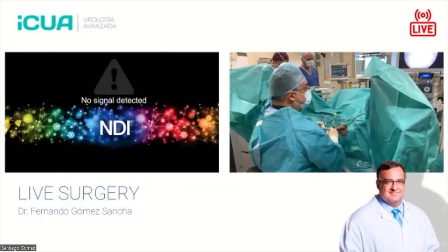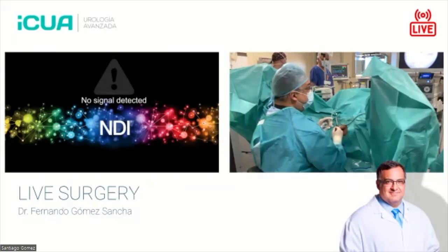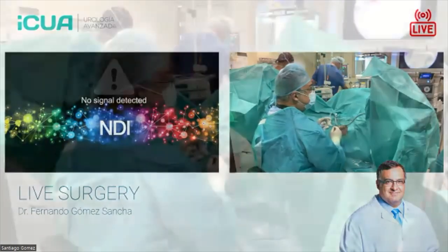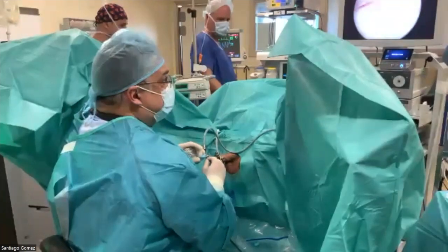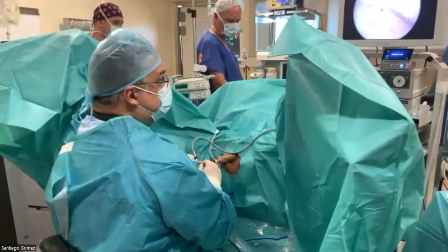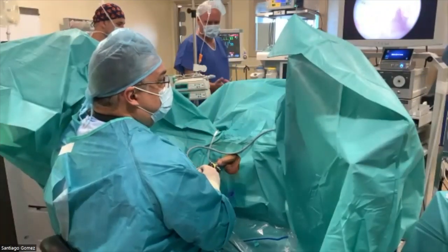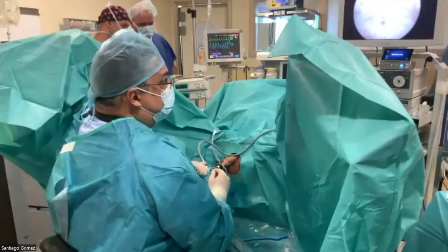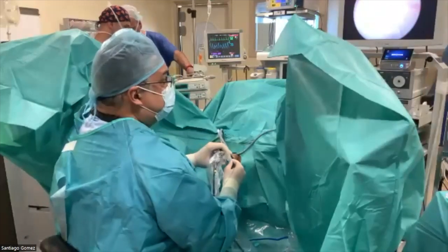I don't want to go deep, for example, here and continue here and do short movements, because this is going to create an irregular line of dissection. I'd rather go like this and follow through. I try to position the scope so I can have a look at the capsule and the adenoma at the same time.